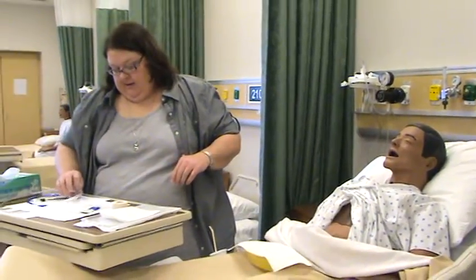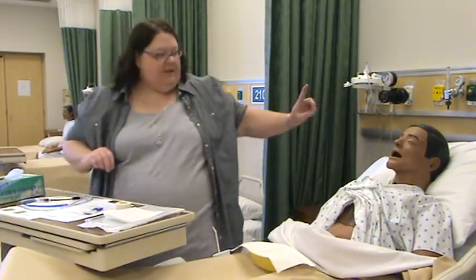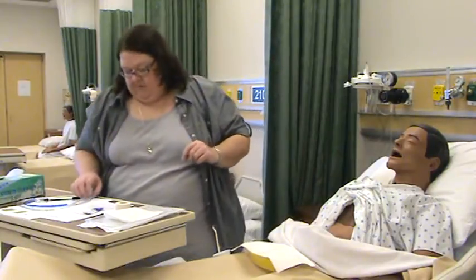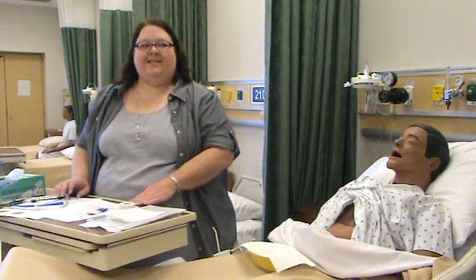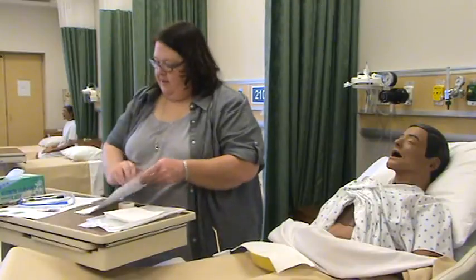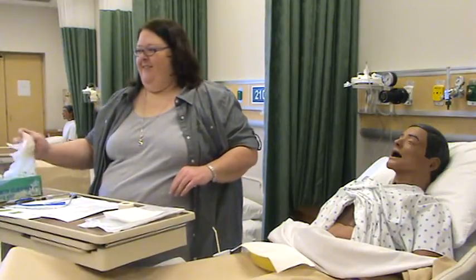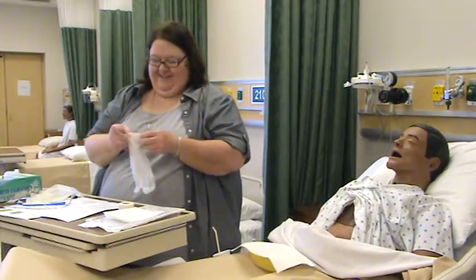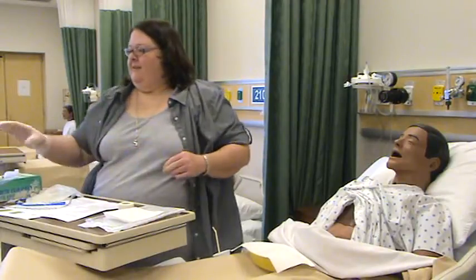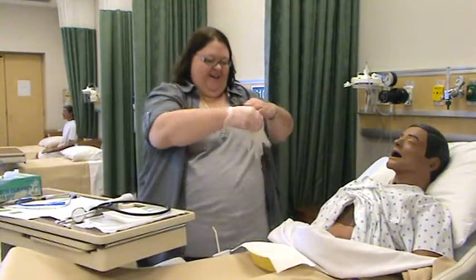I forgot to get a 60 milliliter catheter tip syringe and a stethoscope, so I'm going to push the call light and have my nurse's aide come and get those for me. You rang? I need a 60 cc syringe with a catheter tip and a stethoscope, please. Awesome, thank you. Coffee on me later.